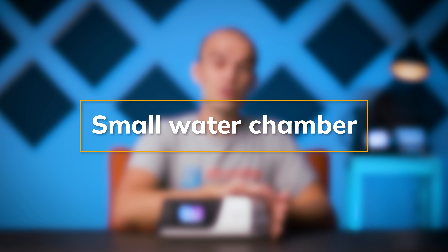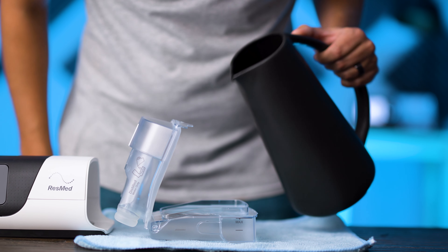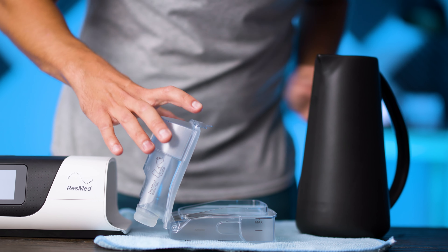Reason number one. Many users of the AirSense 11 complain about the unit's water chamber. The chamber has a sloping seal, which means the water regularly spills out of the back when you're trying to fill it up to the max line. This frustration is made worse by the fact that the chamber itself is smaller than previous models of AirSense, so many users need to fill the chamber more than what they're used to.